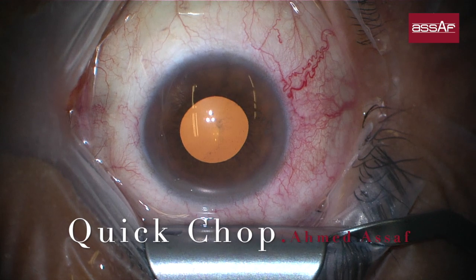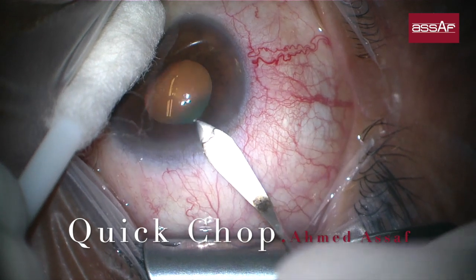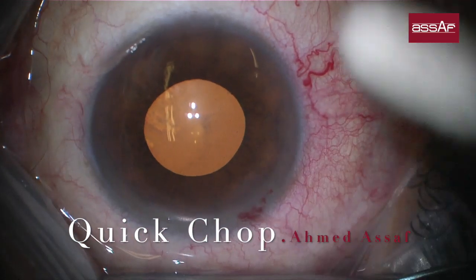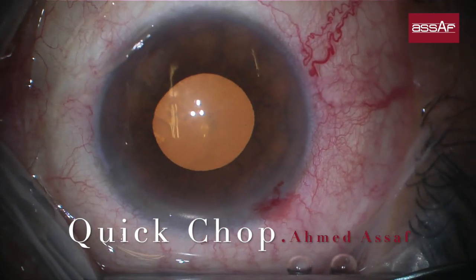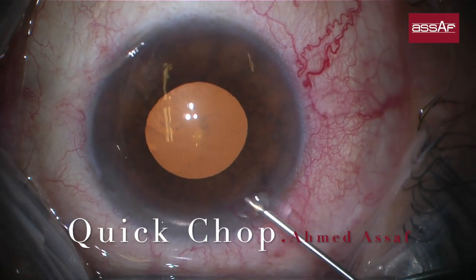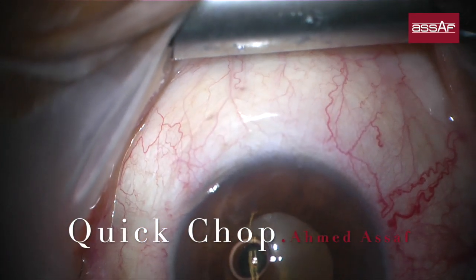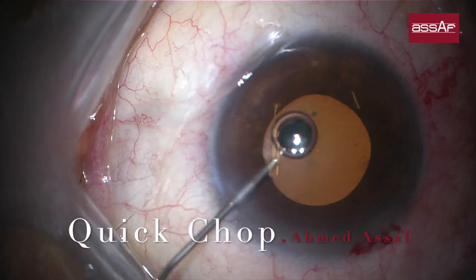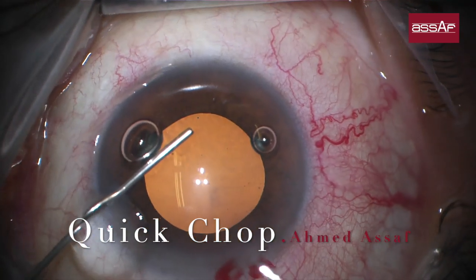The quick chop technique is a standard technique in eyes with nuclear cataract grades 2, 3, and 4. One of the advantages is to reduce ultrasound energy consumption inside the eye and to preserve the corneal endothelium, especially in eyes with corneal guttata or similar corneal endothelial dystrophy. Another advantage is that this technique can be applied in cases of poorly dilated pupils, around 4.5 or 5 millimeters.